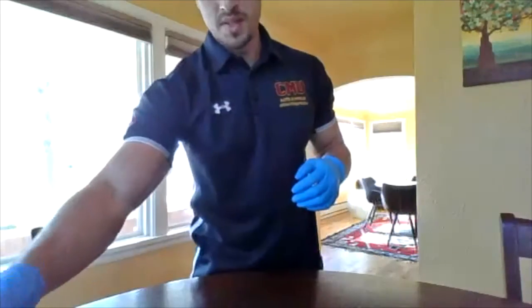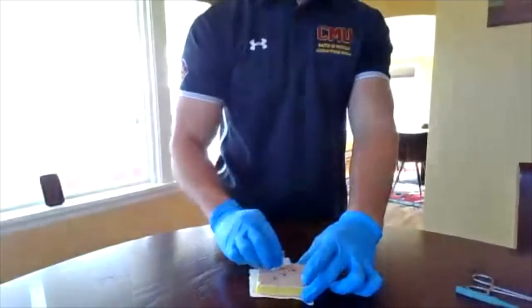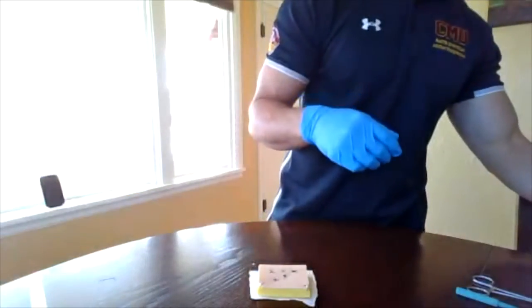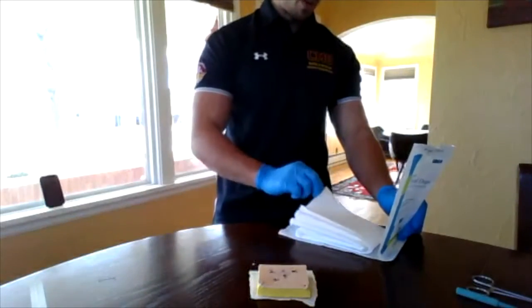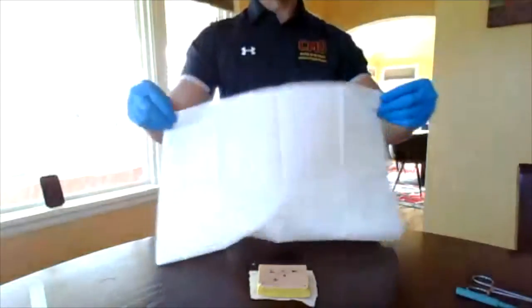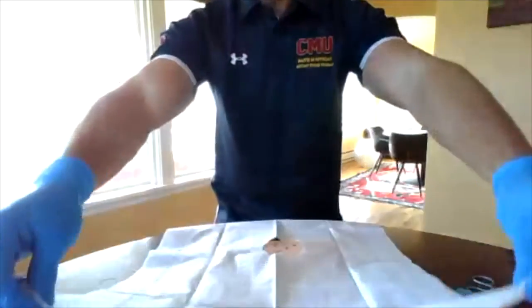All right, then we will sterilize the lesion with the alcohol swab. All right, then the next step in the procedure is to use a sterile drape or a sterile towel drape. So you want to grab the corner and then shake it out. Well, don't shake it out. But so then at this point, you want to place it over, try to get it the first time. Don't go over it and then drag back, okay? Because otherwise it makes it unsterile anymore.